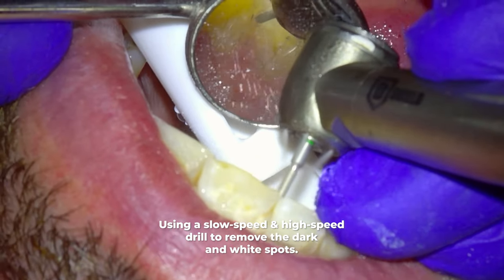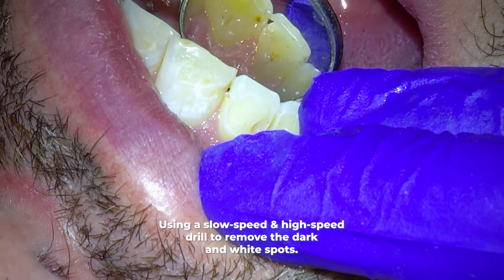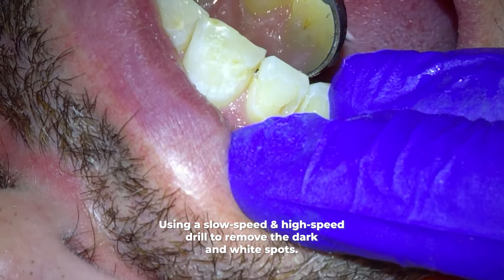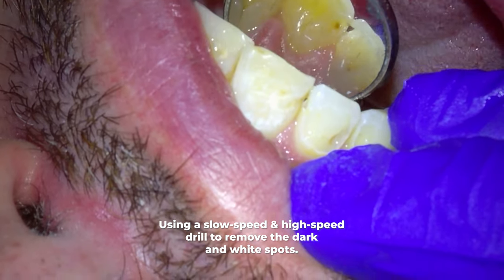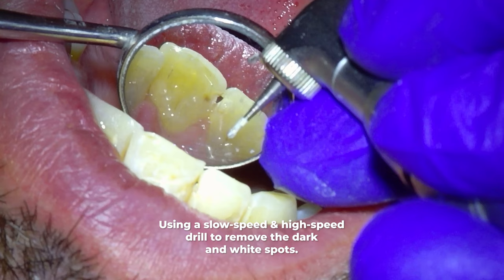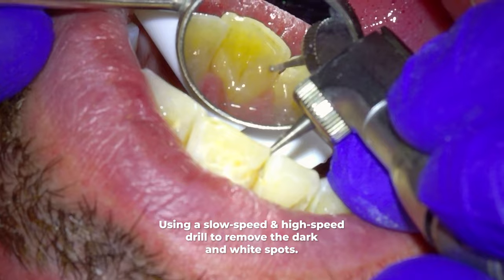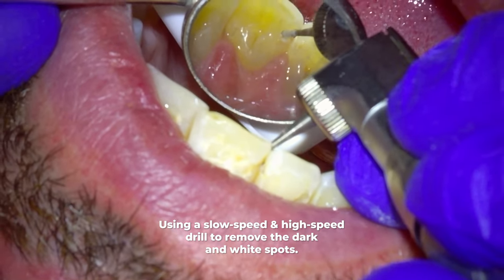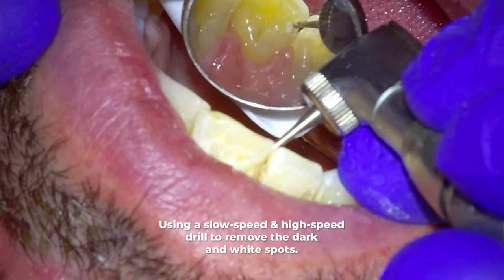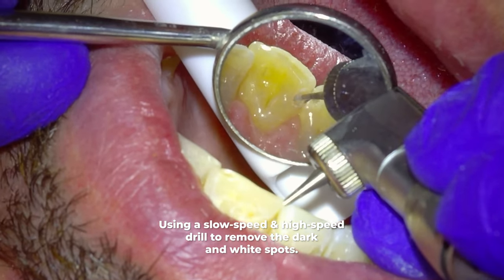If you stop looking through my mirror — even though that's what I'm using — you can start to see the decay coming out of the front side of the tooth. If I pause the video right now, in the mirror you can see a dark spot where I removed the decay that was peeking through and showing on the front side of the tooth before. This discoloration is from the shadow picked up from the back of your mouth and will lighten with the filling in place. We also drill out the cavity right next to it on the adjacent tooth as well.